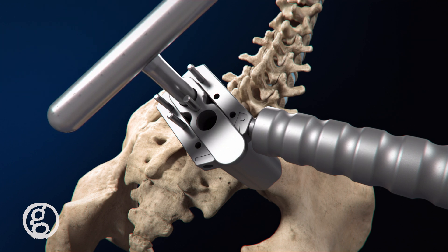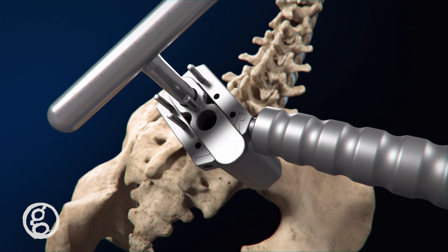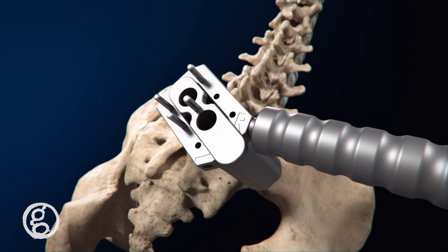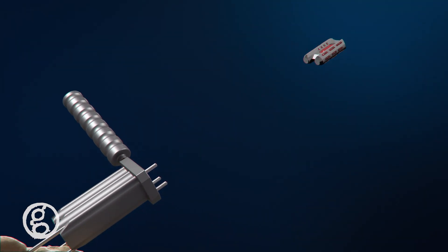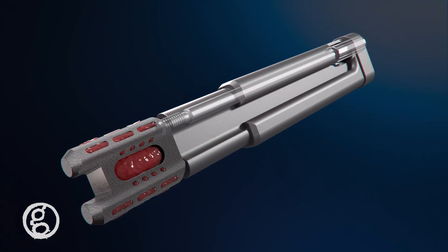A temporary pin maintains position as the second pontoon channel is drilled. The drill guide and graduated guide wire are removed. The Catamaran's open framework and fenestrations are designed to be filled with bone graft to promote bony ingrowth.